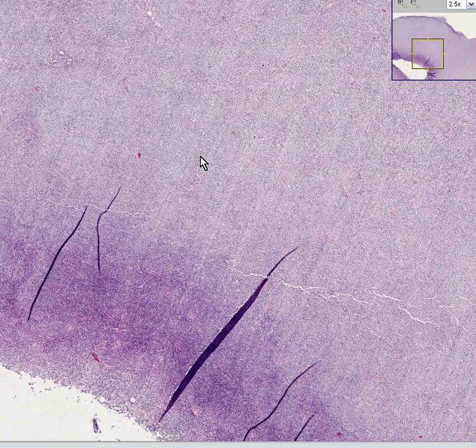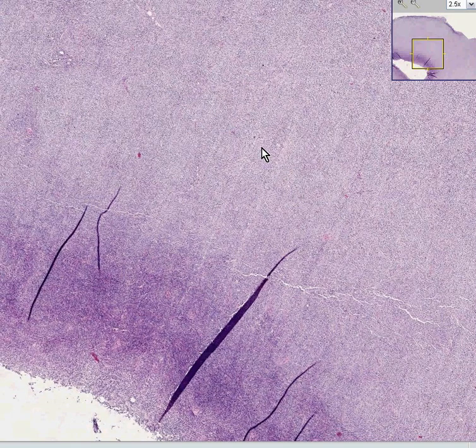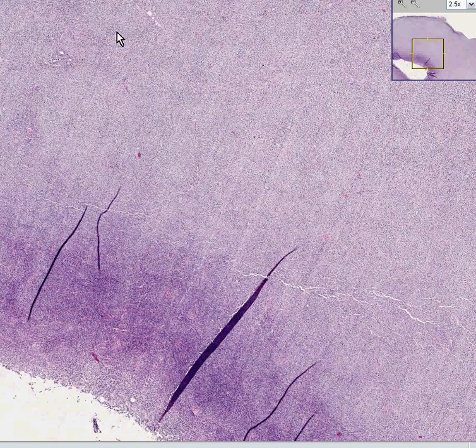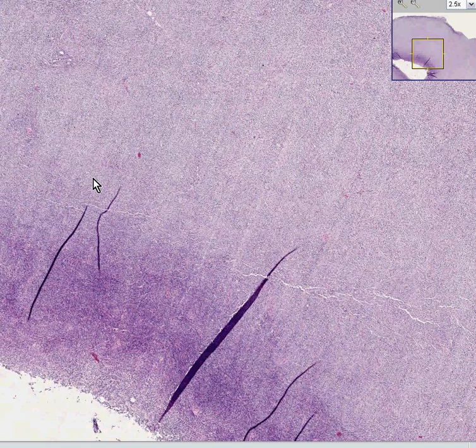We already know that it's a malignant lymphoma. We already know if we look pretty hard and there's no Reed-Sternberg cells that it's a non-Hodgkin's lymphoma. We can already see that the pattern of lymphoid cells within here is diffuse rather than forming follicles.